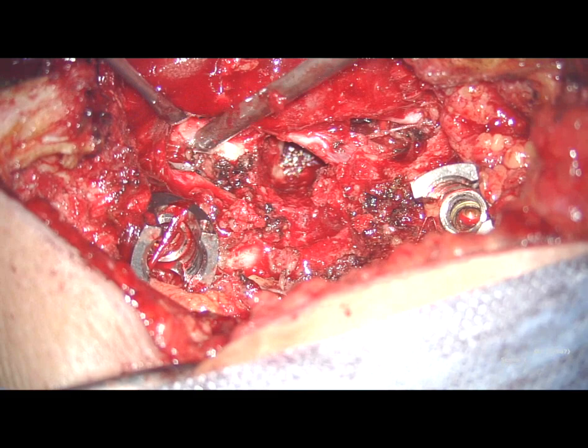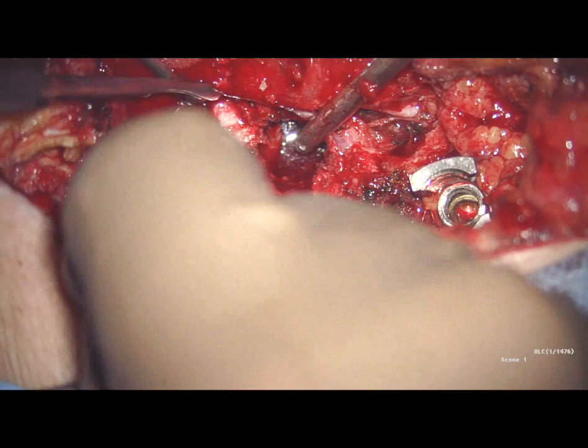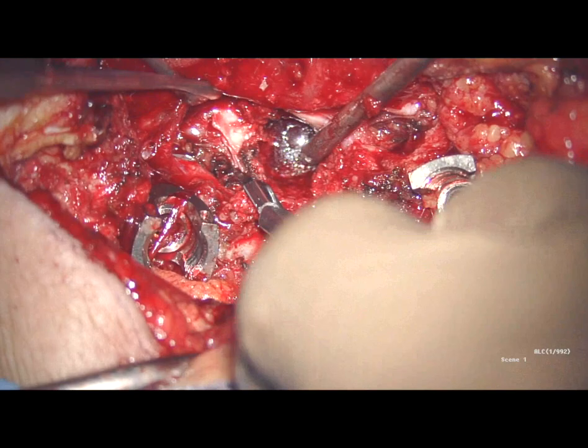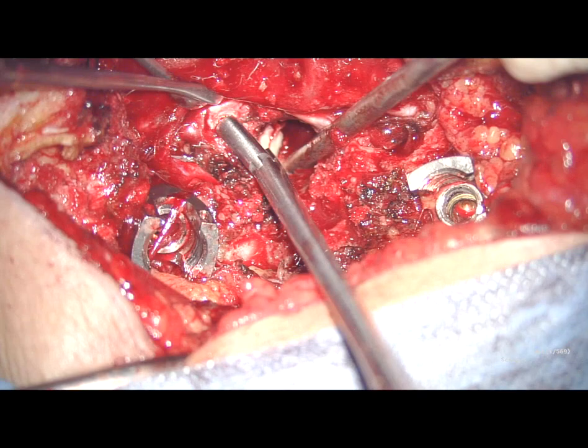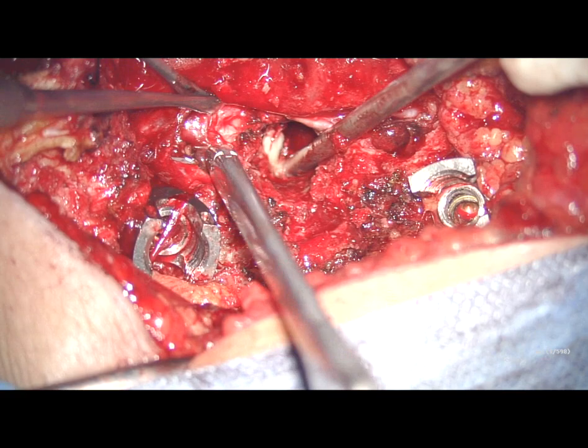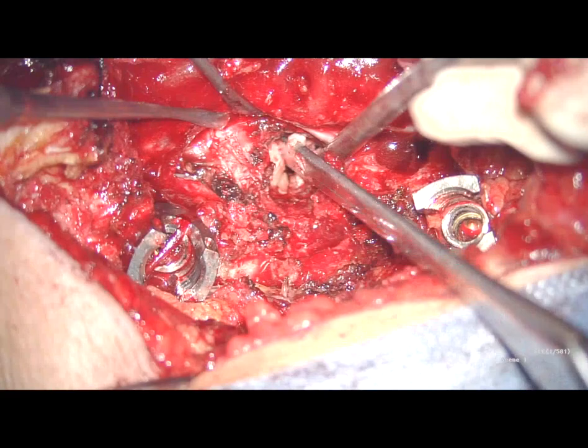An L3-L4 discectomy is done. The L3-L4 disc is removed from the edge of the end plate.